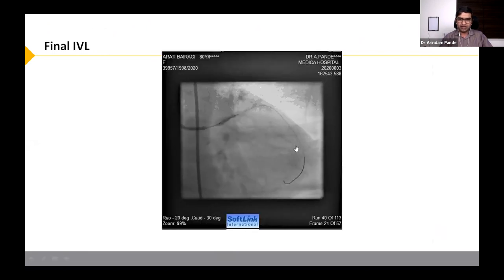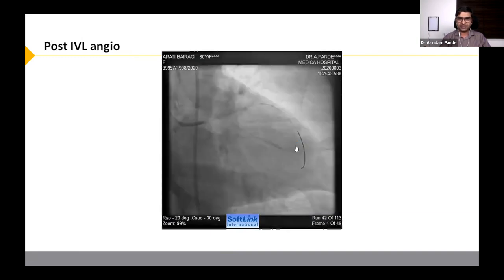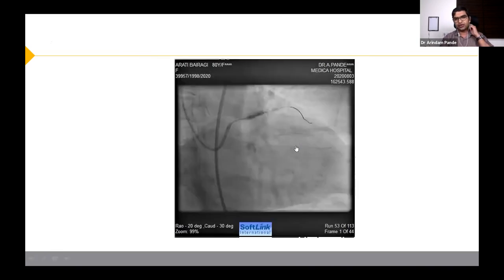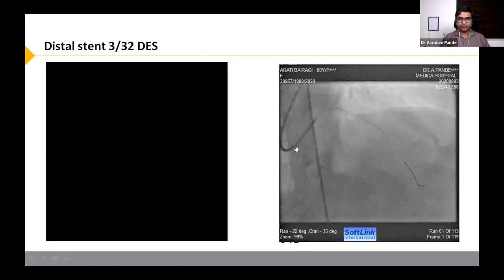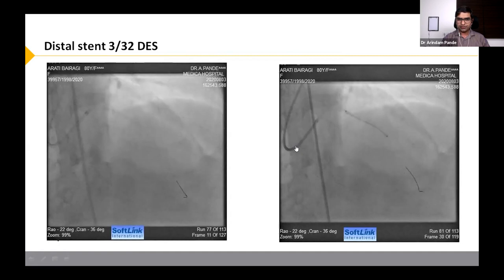See, this is the left main IVL, and in spite of giving 80 bursts, we thought probably more bursts could have been helpful, but as we all know, maximum 80 bursts can be given. And post-IVL angio was not very promising, so we decided to take non-compliant balloons, two non-compliant NC balloons, distally 3 and proximally 3.5 millimeter non-compliant balloon we used. And only after using proper pre-dilatation with non-compliant balloon, even after IVL, then the lesion actually opened up. We took stents, a couple of stents. Distal one was 3x32. They were Ultimaster stents. And there was not much of a problem in negotiating the stent.